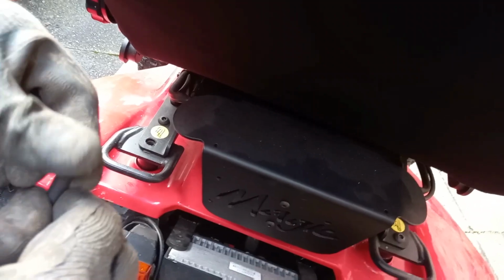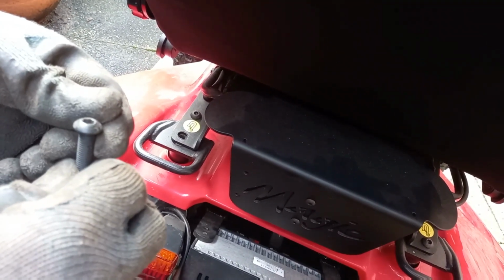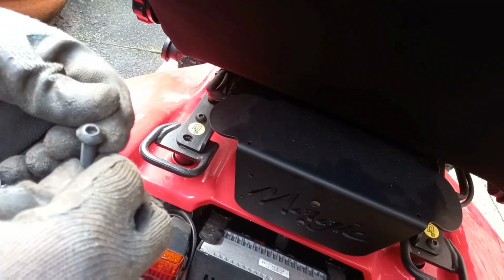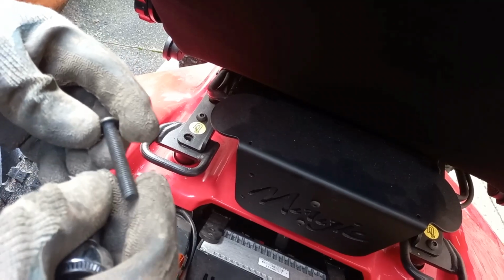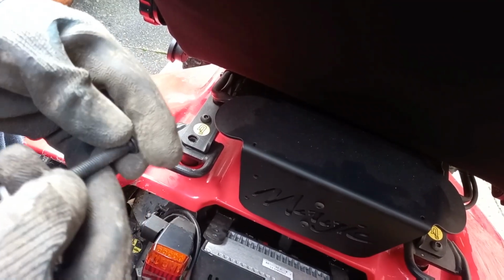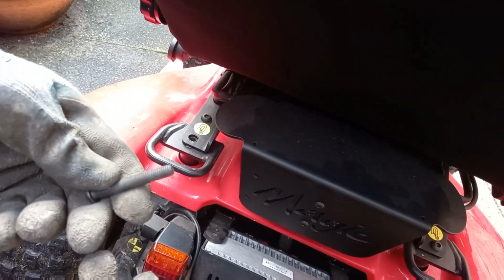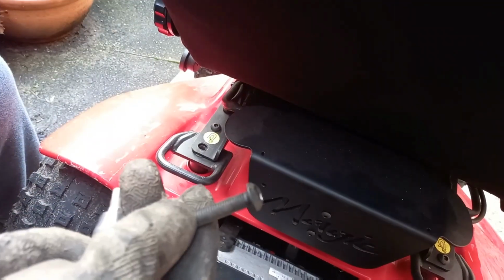Well, I will say one thing. They have used 12.9 tensile strength, which is higher than 8.8, which would be your usual ones. So they are actually better fasteners, but they haven't got any anti-corrosion plating on them or anything, which is a bit bad, but never mind. Anyway, right, we'll do some more.